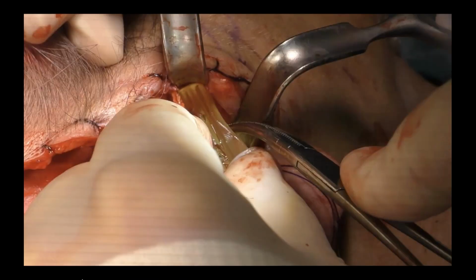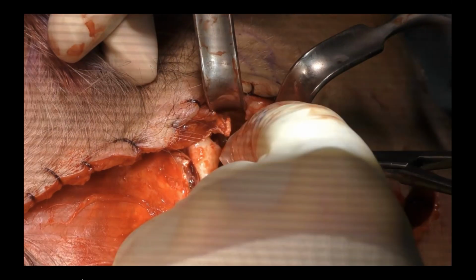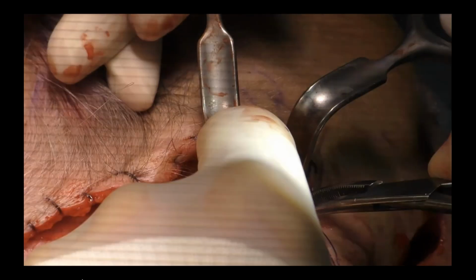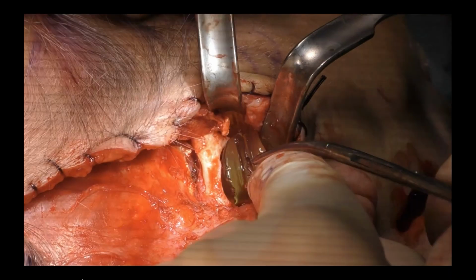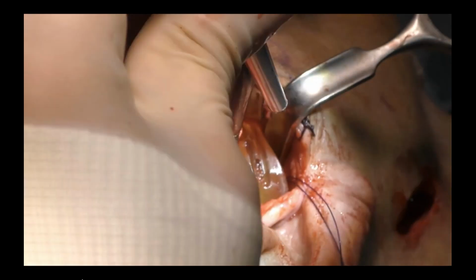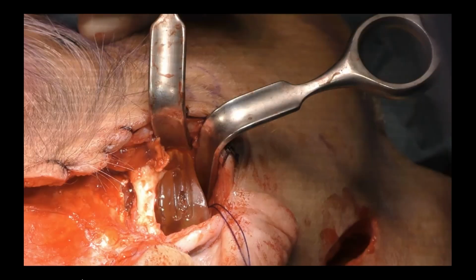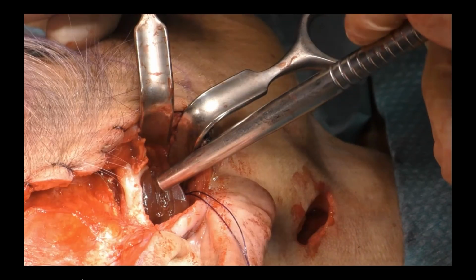If you don't do this, you will find yourself struggling a lot with the titanium fossa component that is not fitting well, goes in and out, and in the meanwhile just attracts bacteria. So make sure that your dummy fossa fits perfectly well, and I recommend to use a mallet. Hammer it in.